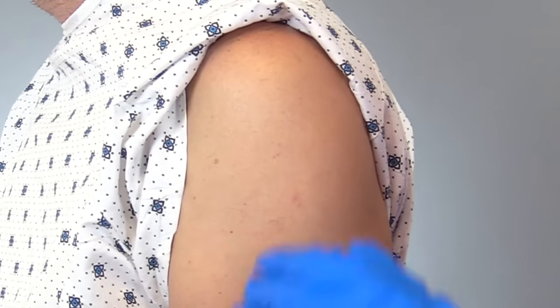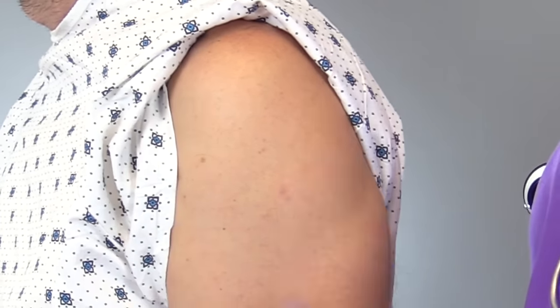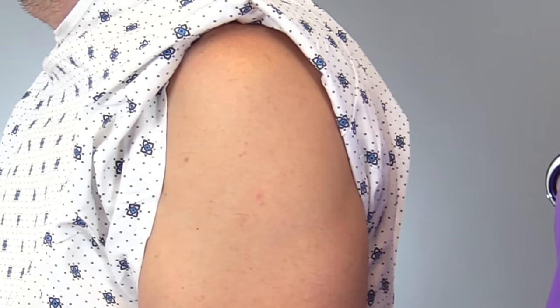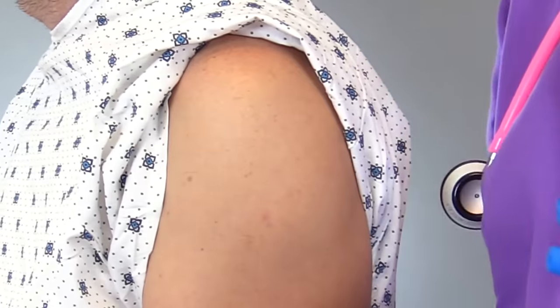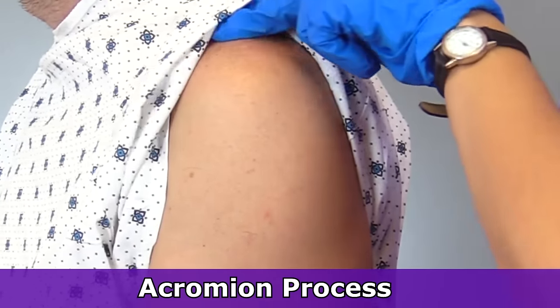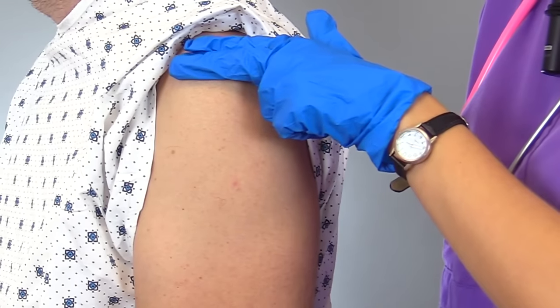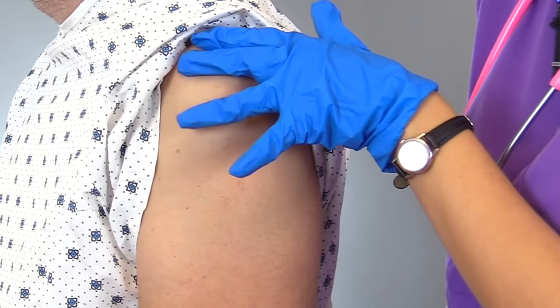We're going to the deltoid muscle, located up in this area. Have the patient completely relax their arm — you do not want this muscle tensed up because it's going to be more painful for them. Then we're going to find our injection site using landmarks. Our first landmark is called the acromion process, found high up where the shoulder is — it's a bony prominence that's really easy to find. From there, go about two fingers width down, right here in this area.